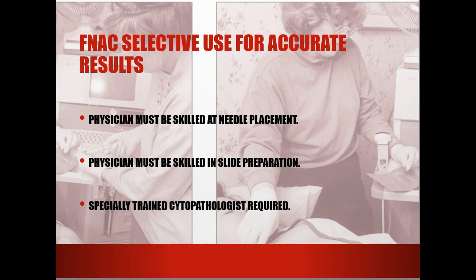What we've used most is a radio frequency signal. You can put that into the lady's breast, and she doesn't have a wire hanging out or anything. You put a Band-Aid over the breast, she's good to go.